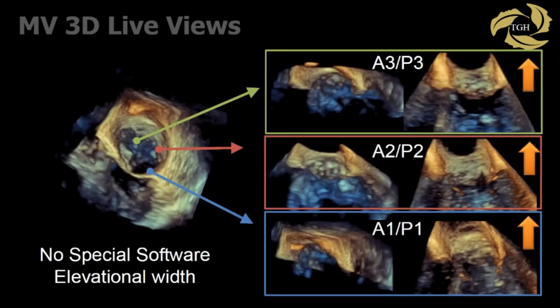You can also just look at 3D live views. This is the entire mitral valve in 3D live. What you can do is use your elevational width — as on the Epic machine; GE has a similar product — where you can scroll back and scroll forward. Scrolled back, I'm at A3P3. Scrolling forward — A2P2. And finally, the most forward — A1P1. All I've done is slice through the mitral valve using 3D live. And if I'm looking for prolapse, I can tilt this to look through a true sagittal section. Very simply, you can look at a mitral valve without any specialized software.